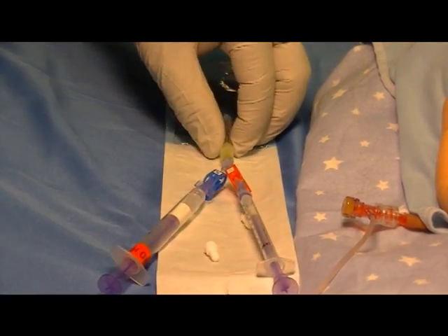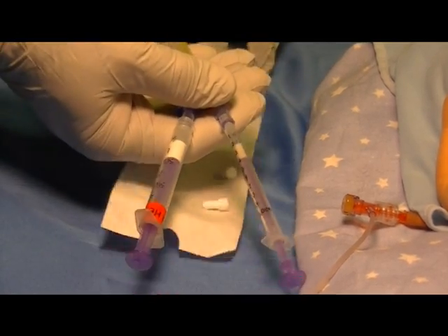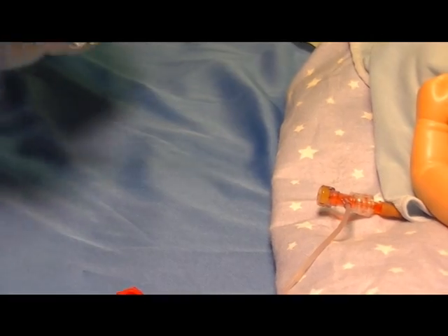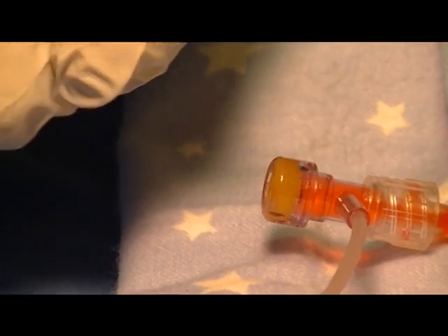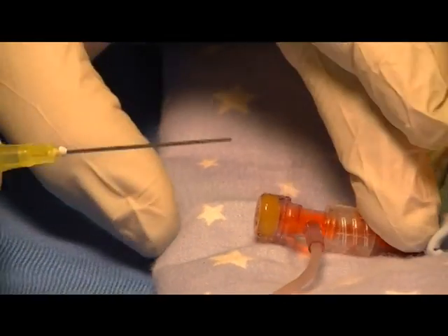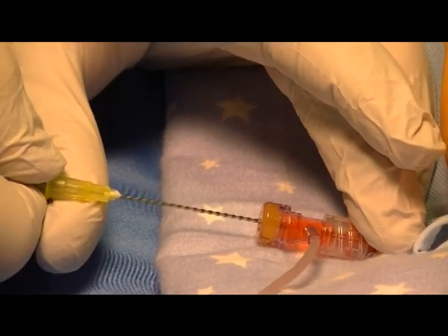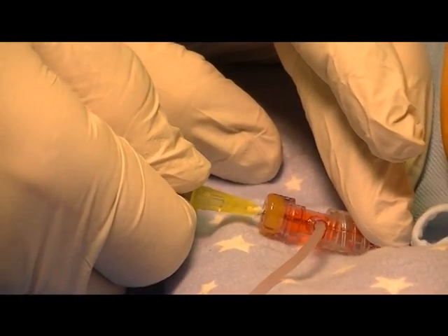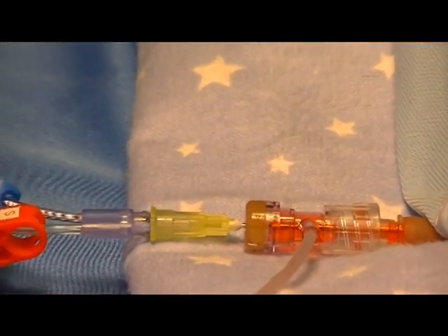Now you're ready to actually insert the Humi micro draw into the T-connector. You will go to bedside, remove the sterility cover, and insert the Humi into the T-connector until it fully seats to the full depth of the blunt tube.